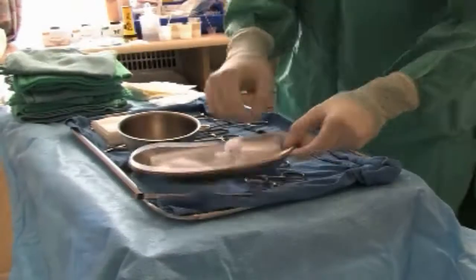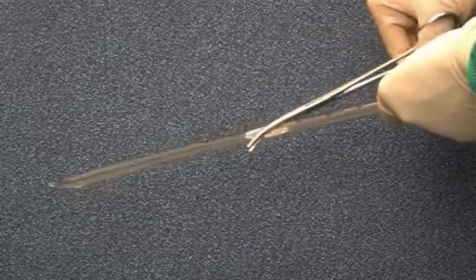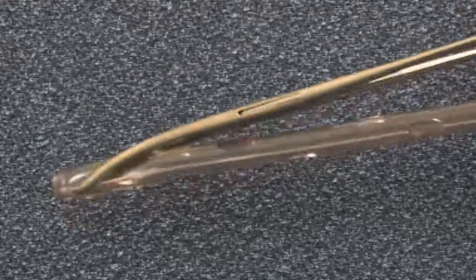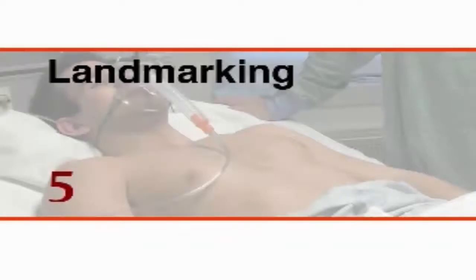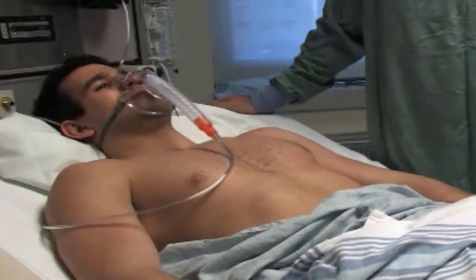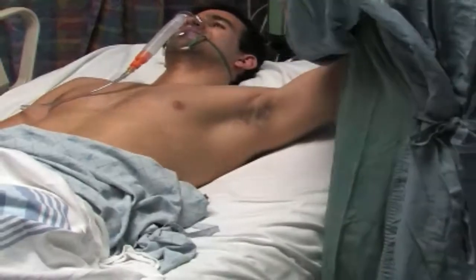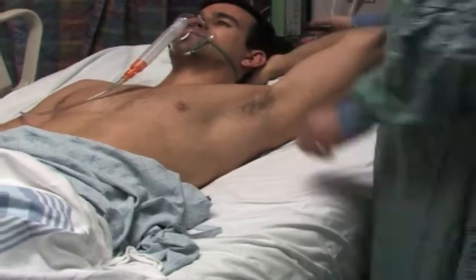Once the chest tube tray is open and all the key instruments are identified, occlude the proximal free end of the chest tube with a clamp or forceps. Next, with another clamp or forceps, grasp the distal end of the tube. This will aid in passing the tube through the tract. The patient should be positioned either supine or in the semi-recumbent position. The ipsilateral arm may be maximally abducted to the side of the patient, or, alternatively, positioned behind the patient's head in order to have optimal exposure of the insertion site.